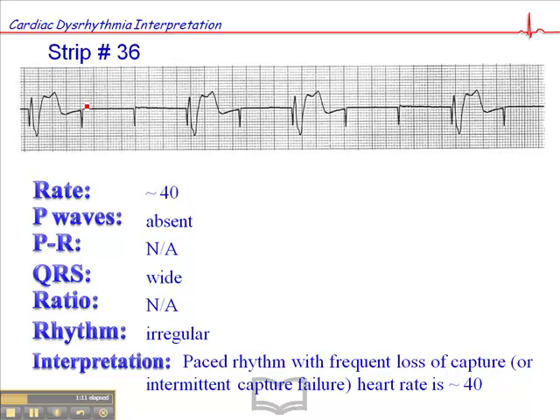When you see pacer spikes that stand alone without a QRS, that means there's capture failure. Now there's electrical capture and there's mechanical capture. Failure of electrical capture means we see a pacer spike without a QRS — that's loss of capture. If we check for a pulse and there's a pacer spike with no pulse, then that's failure of mechanical capture. We should be able to feel a pulse with successful capture — that would confirm mechanical capture. We know there's electrical capture when we have a pacemaker spike and a QRS complex.